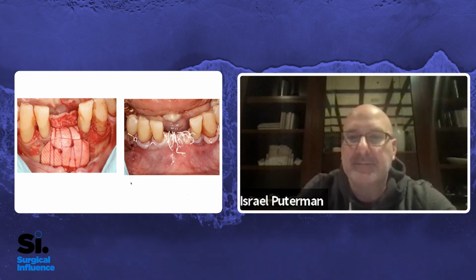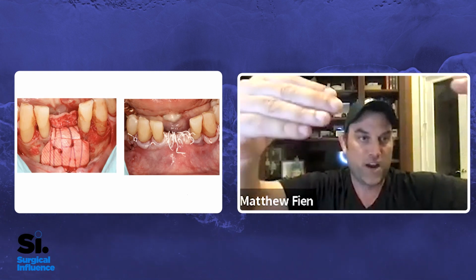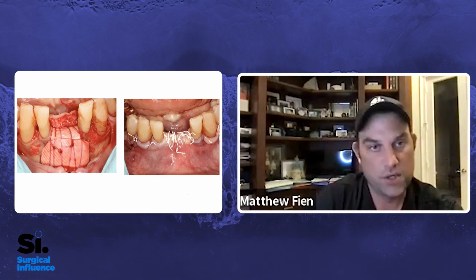I love that. And when we're using a resorbable membrane, we're so tempted to take one big piece and try to cut it so it's like a trapezoid, so it kind of folds over the crest, but it's never enough. It's never large enough. So I love this doctor here took a piece and clearly tucked it to create almost like a lingual wall to pack into, and then has the piece on the buccal.